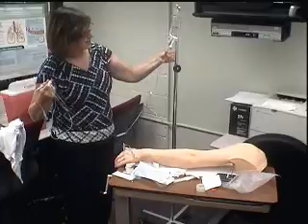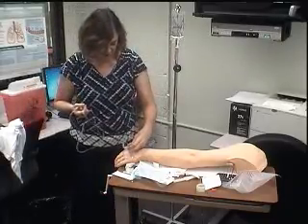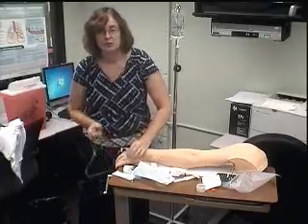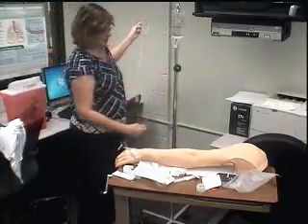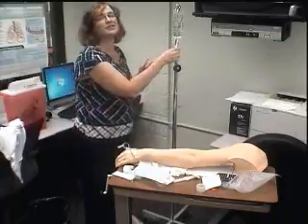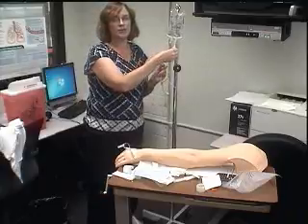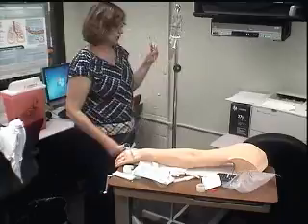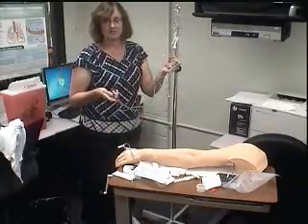And just like I said, I need to prime my saline lock. I need to prime my tubing. If my tubing is not primed, I will be putting air into that person's body. Air will go into the vein. I can have an air embolus, and that is not something I want. And to my knowledge, I don't know if there are any studies on how much air would cause an air embolus. That would not be a study that would be approved, right? Because that could really hurt somebody.